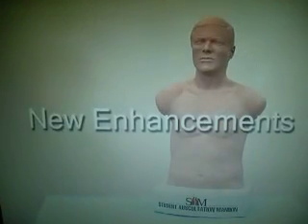Each SAM is supplied with a lesson guide for each sound, illustrating where the sound is best heard, phonocardiographic illustrations, questions and answers. There are 3 new enhancements to SAM.